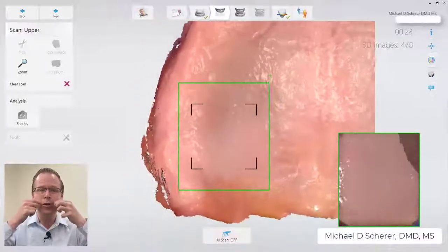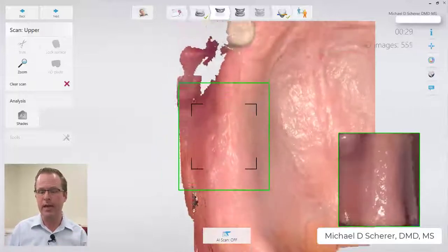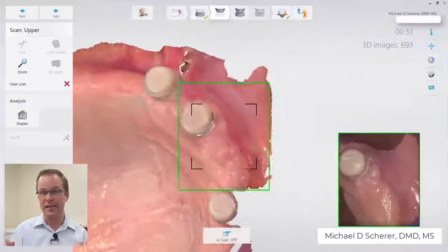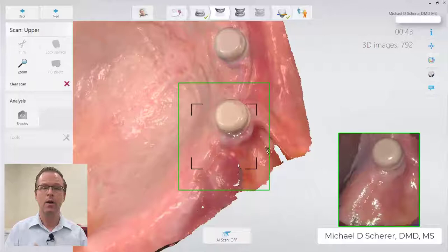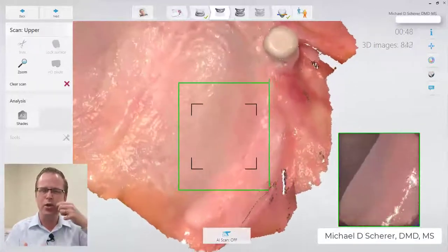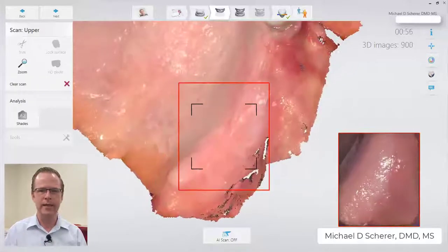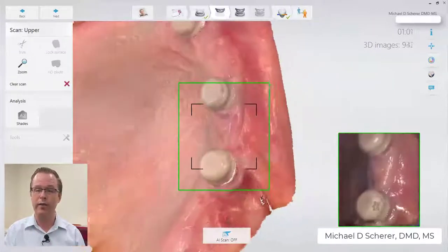My assistant and I are holding the cheeks fairly taut so there's very little movement of the vestibular area. I then start sweeping across in one continuous motion across the pre-maxilla area. At some point I have to switch my hand around to capture the left side of the patient. The trickiest part is swinging around to the back left side while keeping the cheeks stable. Sometimes I pick up a little bit of double image back there, but I just continuously scan over that area and it fills in.